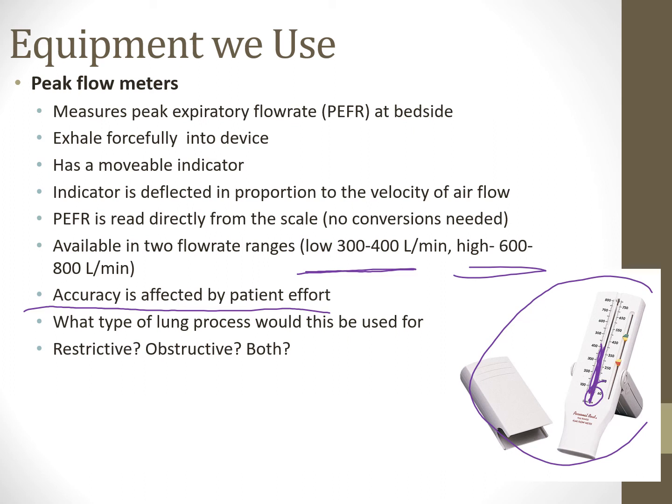This is why we usually have them do 3 efforts, and I'll take the best number of the 3 efforts because it's effort dependent. We're not going to average it. We're just going to take the best number. So do it 3 times: stand up, big deep breath in, blow it really hard, really fast, like you're blowing out candles on a cake. You really want to get the best effort you can out of them. Kids, in my experience, usually tend to give more effort than adults, but that's a whole separate thing. Get as much effort as you can out of the patient, and then record the best value out of those 3 blows.